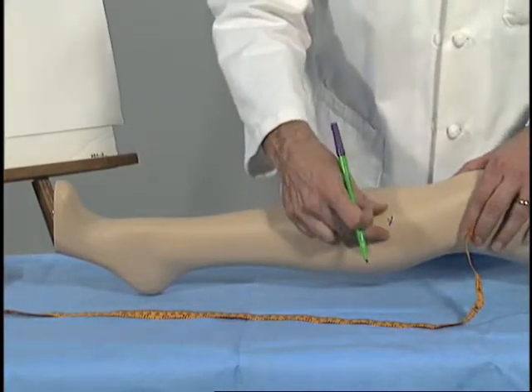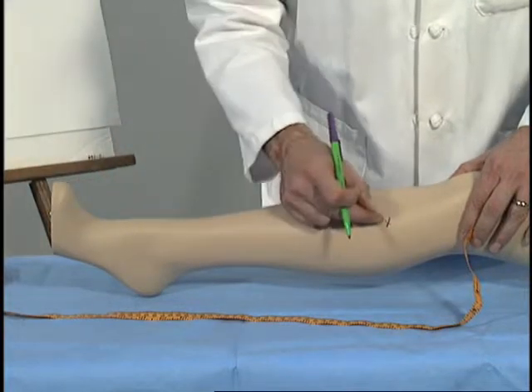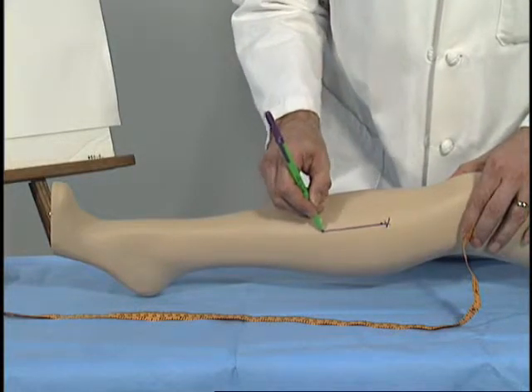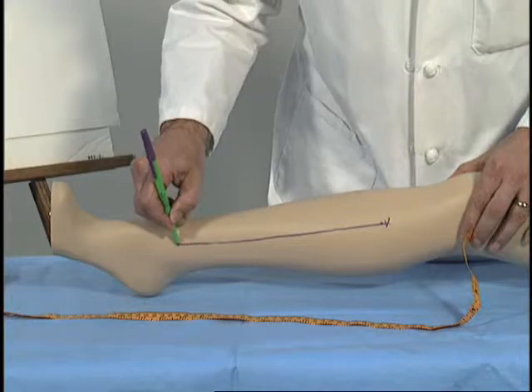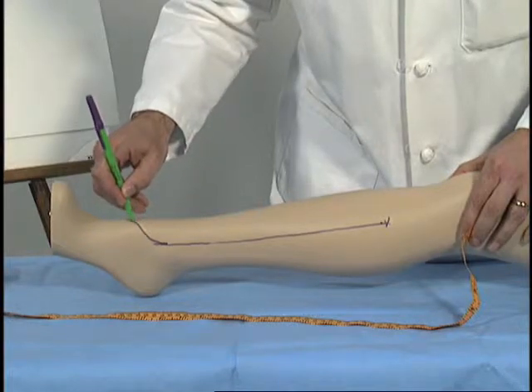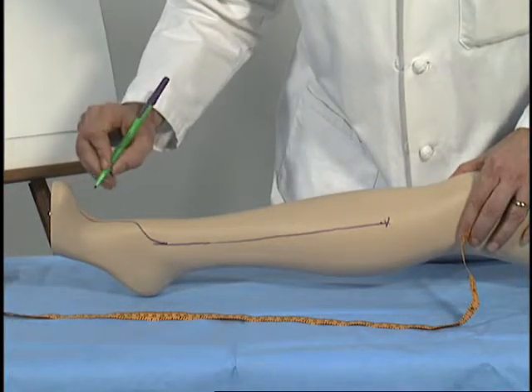We'll then move along the anterior tibial compartment, centered in the middle of the compartment, which typically very nicely overlies the anterior tibial artery. We'll bring this line down to the ankle, where we'll cross along the course of the dorsalis pedis artery and extend down onto the forefoot.